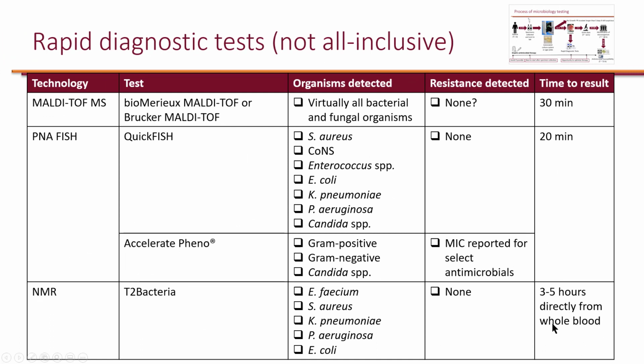So it goes directly from whole blood. Now, unfortunately, currently it cannot detect resistance, but it can detect these organisms pretty quickly.